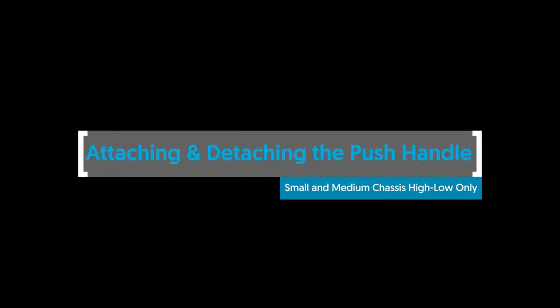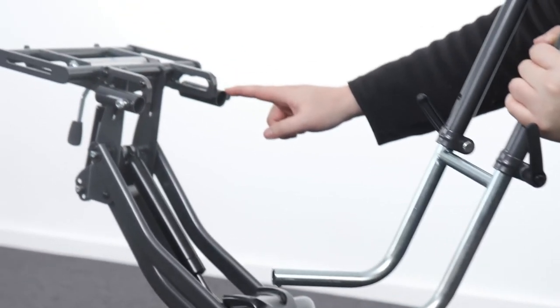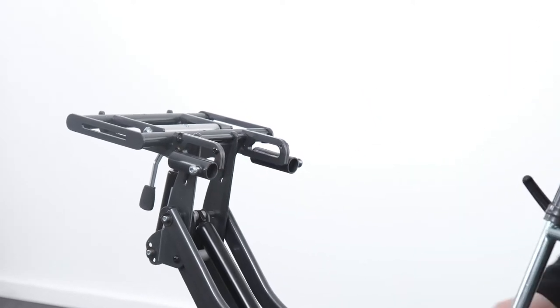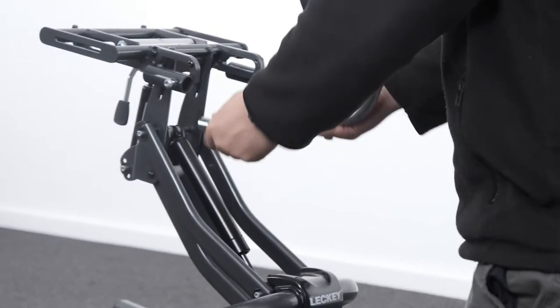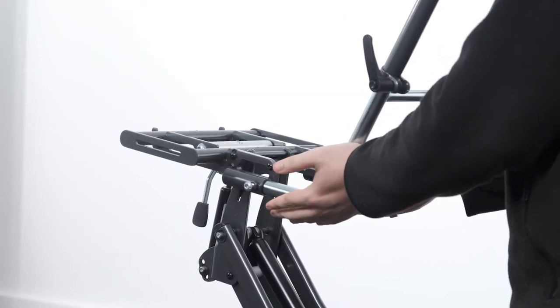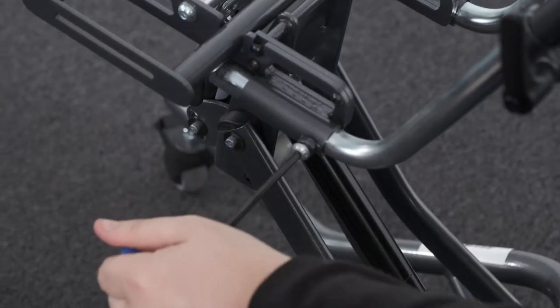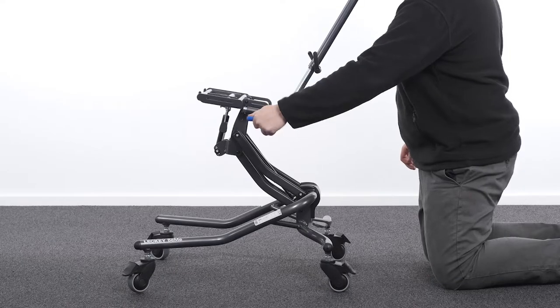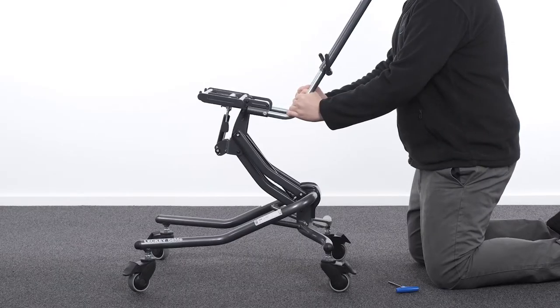Attaching and detaching the extendable push handle — small and medium chassis high-low only. The push handle is attached to the high-low chassis by inserting the two lower stems into the receiving tubes as shown. The push handle has safety poppers which need to be pressed in when inserting the lower stems. Push the stems in until the poppers protrude from the other end of the receiving tubes. Secure the handle in place by tightening the locking bolts. To detach, reverse the steps then press in the safety poppers and pull the handlebar tubes out of the lower stems.